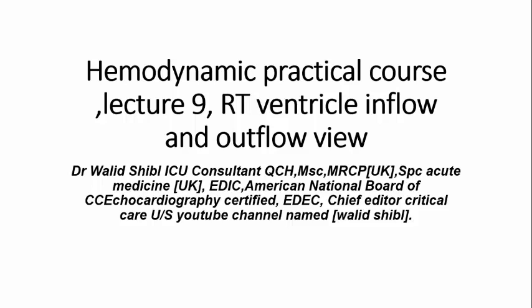Today, we'll talk about the long axis parasternal view, right ventricular inflow and outflow view. These are very important views because they are easy to get, and at the same time, you can collect very important information from these views. Let us see on a volunteer how easy you can get these views.